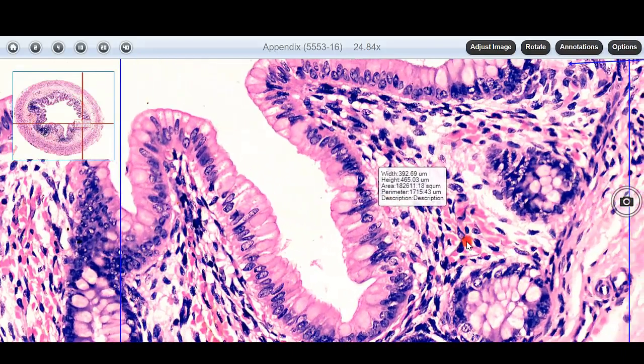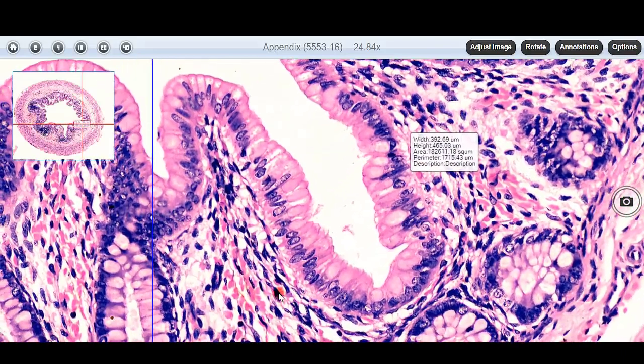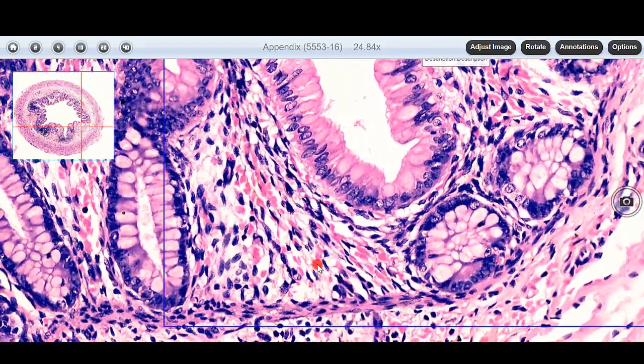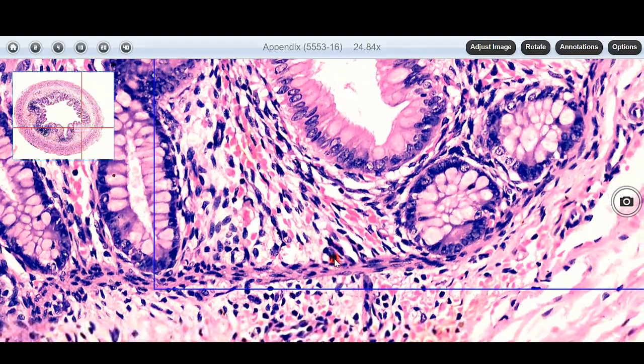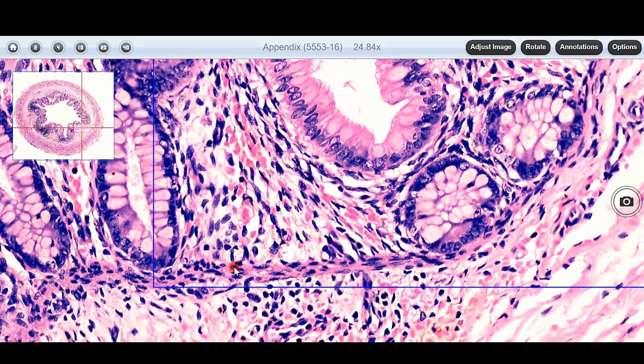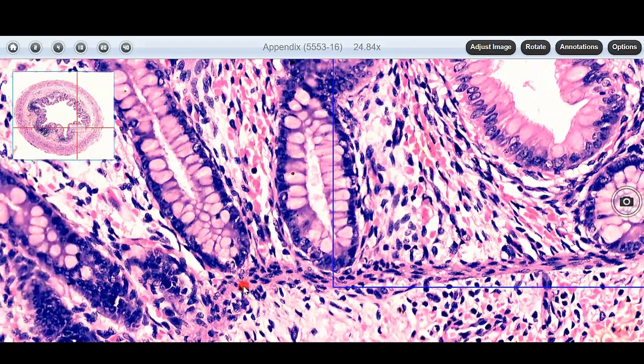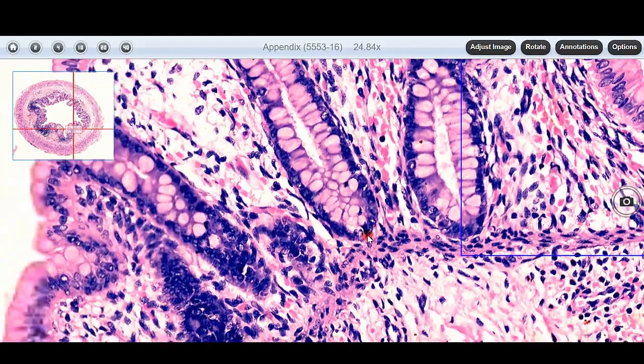Then we have the lamina propria containing lymphocytes, and then comes a thin layer of muscularis mucosa.